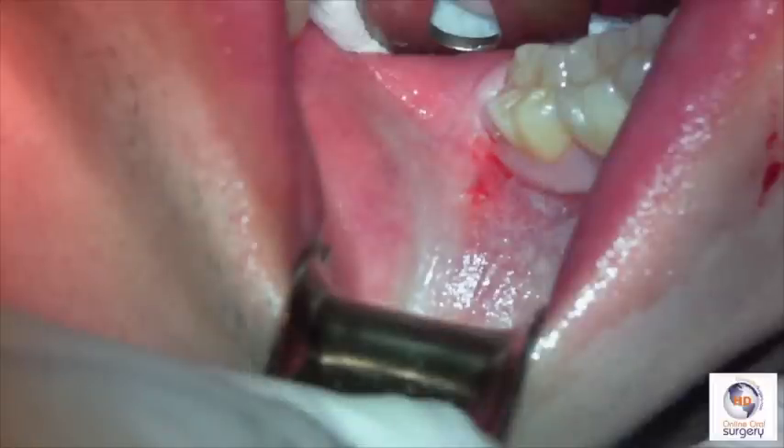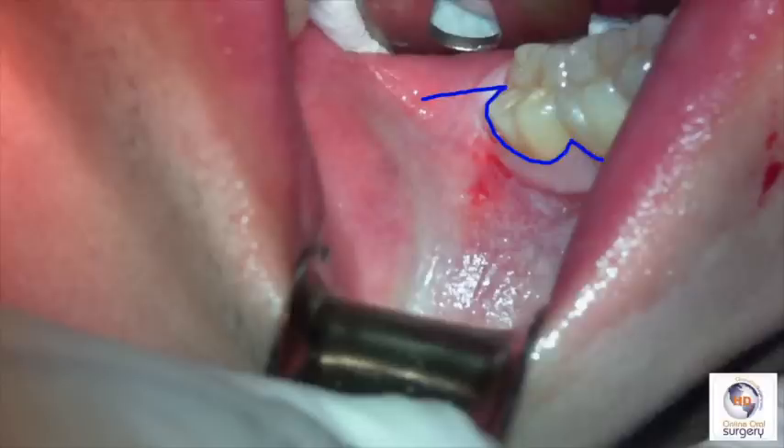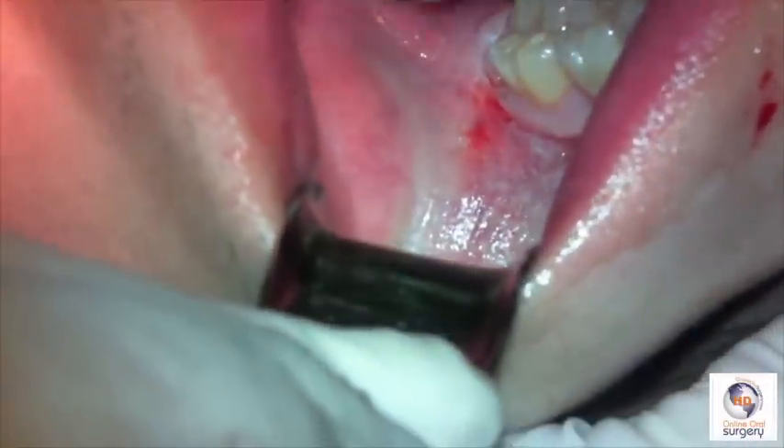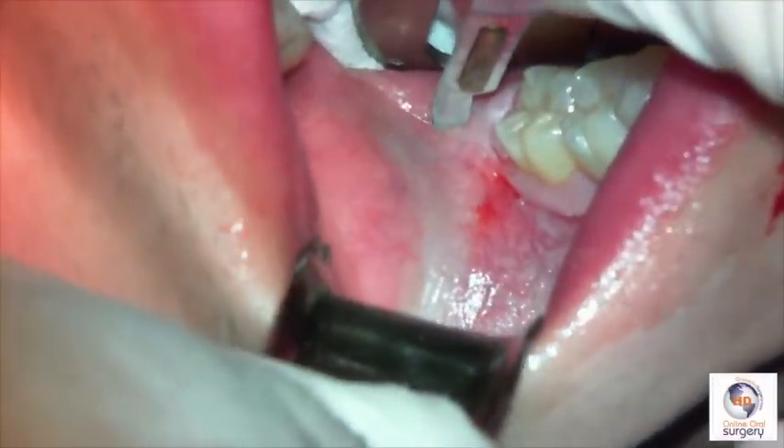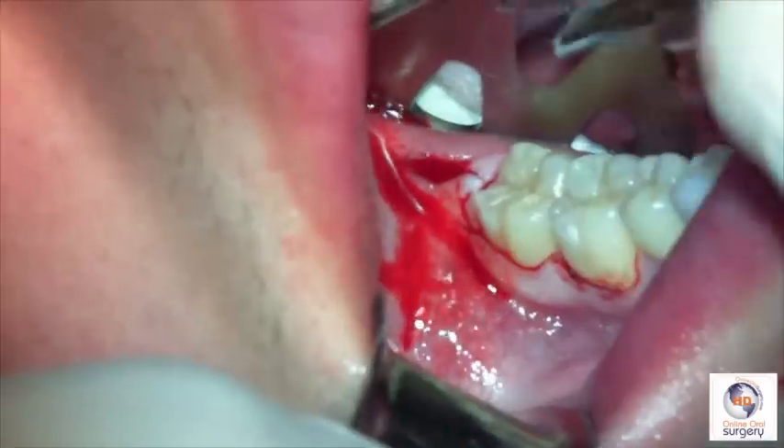Let's take a look at our surgical site for number 32. It's completely covered by healthy mucosa. We're going to begin our access by making a sulcular incision, beginning around the distal buccal line angle area of the first molar, carrying out through the papilla between the first and second molar, and then posteriorly onto the retromolar region. We need to be conscious of the buccal-lingual positioning of the distal extension of our incision because of the variability of the lingual nerve — we want to be no more lingual than the central groove of the second molar. We begin our incision on the retromolar area with a sharp number 15 blade, then connect to the sulcular incision at the disto-buccal line angle of tooth number 30, carrying it distally and connecting the two.